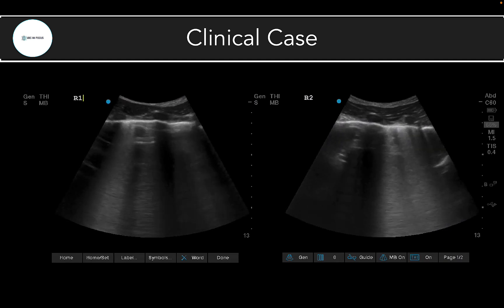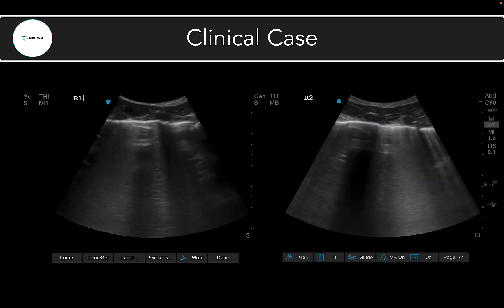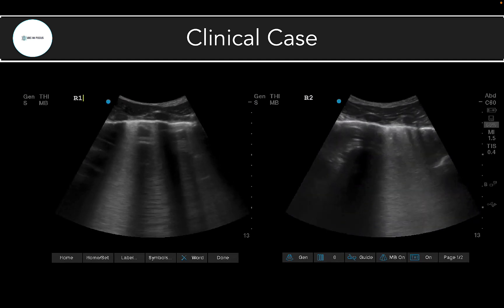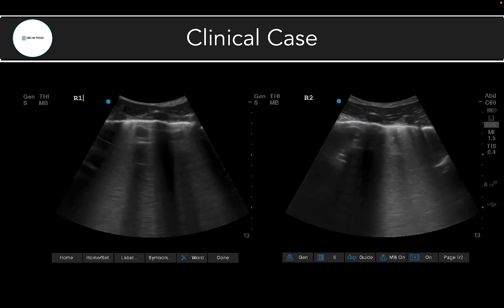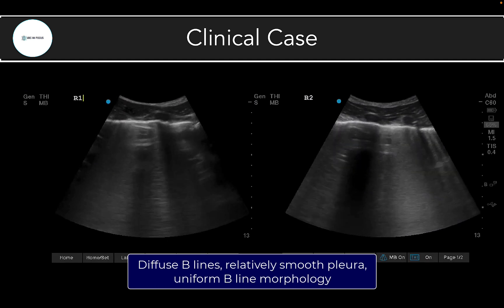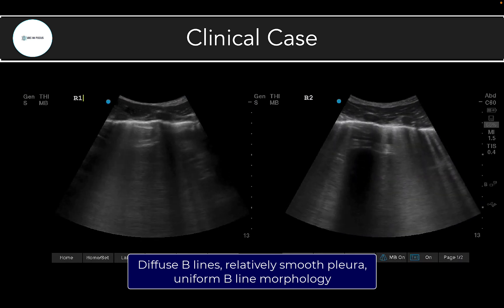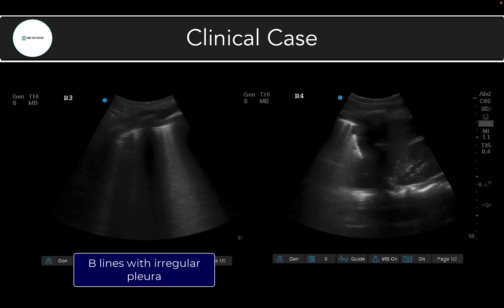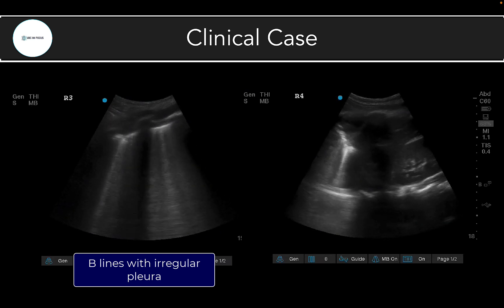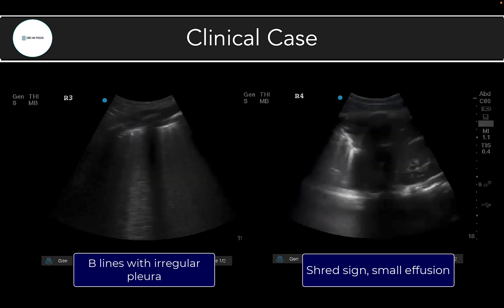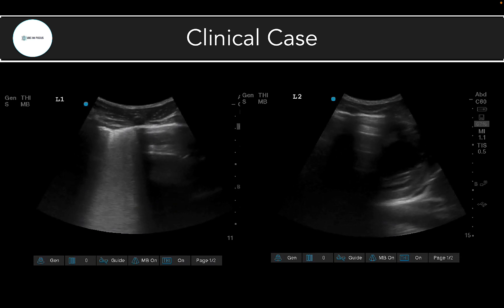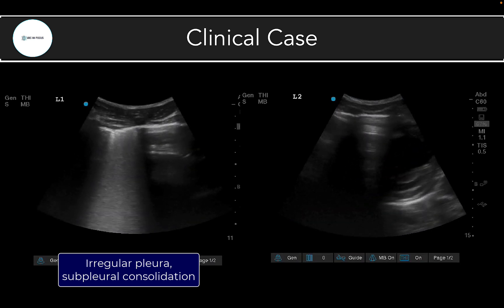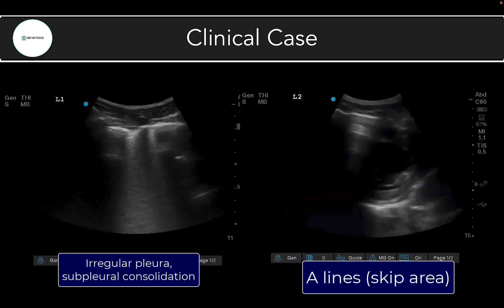Here's a quick case to illustrate these principles — clinical information is omitted intentionally to focus on the lung ultrasound findings. Looking at lung ultrasound clips from the right anterior chest (R1 and R2), we see diffuse B-lines across several rib spaces with a fairly smooth, uniform-appearing pleura, and the B-lines themselves also appear quite uniform. Moving to the right lateral chest (R3) and right base (R4): in R3 we still see B-lines, though starting to look less uniform across the rib space with some pleural irregularity. In R4 at the right base, we see a shred sign and a small pleural effusion.